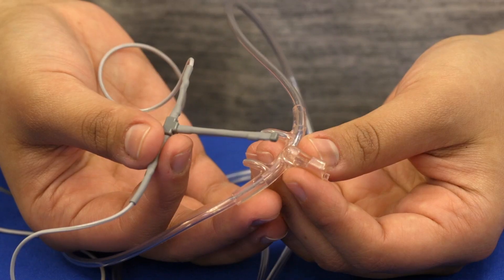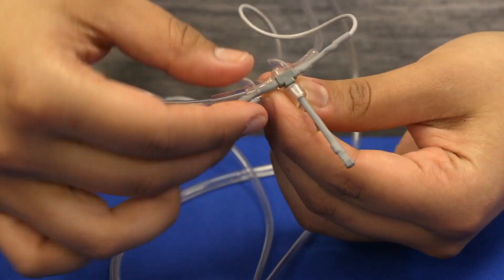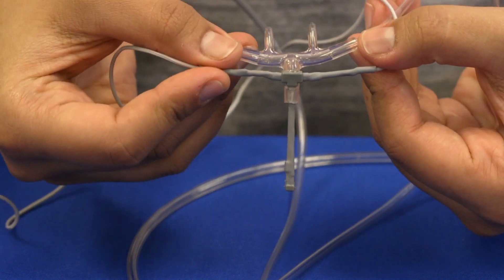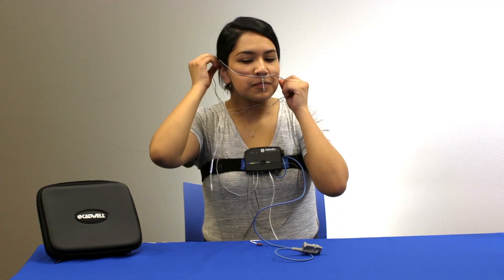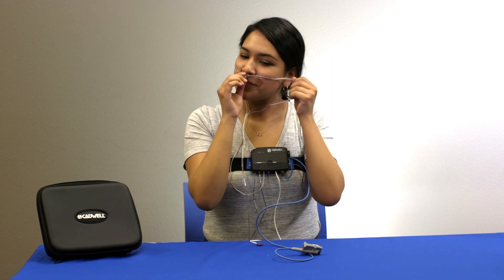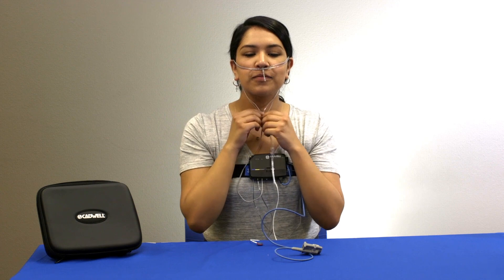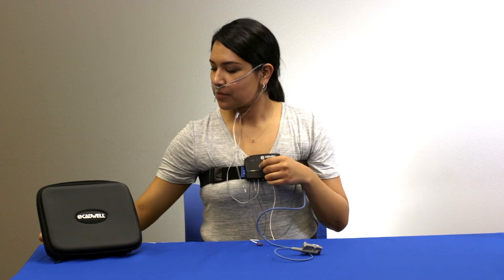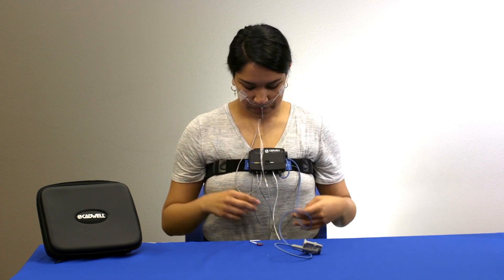Insert the gray thermal sensor away from you through the holder on the cannula. Holding the cannula with the prongs facing towards you and curving down, insert the ends of the prongs into your nose and pull the cannula tube and thermal cable back over your ears like a pair of glasses, so that the wire sits in front of your neck where it connects. Slide the tension adjusters up the cannula tubing and the thermal cable. This should not be tight or uncomfortable. Tear off two small pieces of tape and secure the tubing and wire to your cheeks.